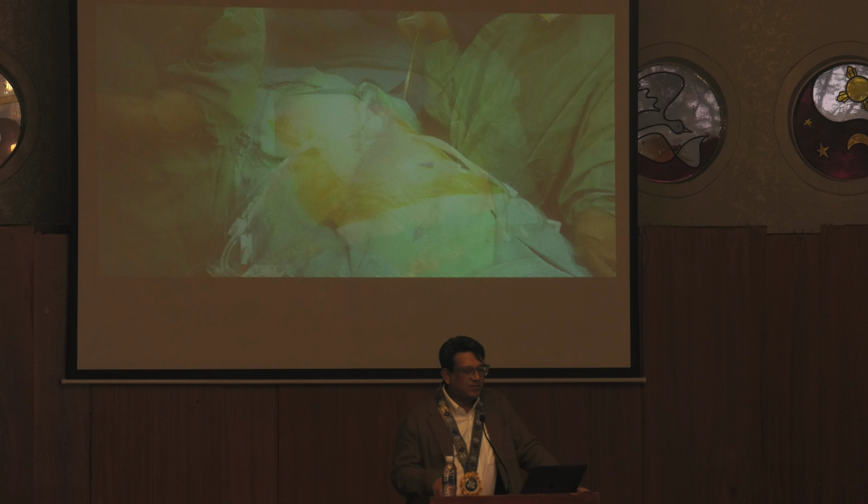We can also do this laparoscopically, like I mentioned, not robotically, but laparoscopically, and also robotically. So laparoscopic is we're putting a camera inside. You can see these white spots. Those are the cancer cells, cancer deposits. And so we can remove all of this laparoscopically without giving incisions.